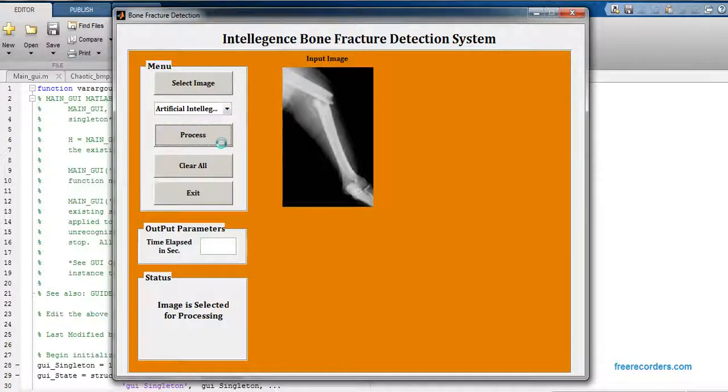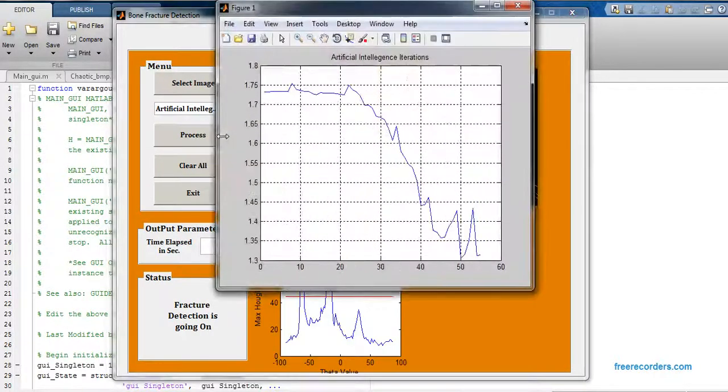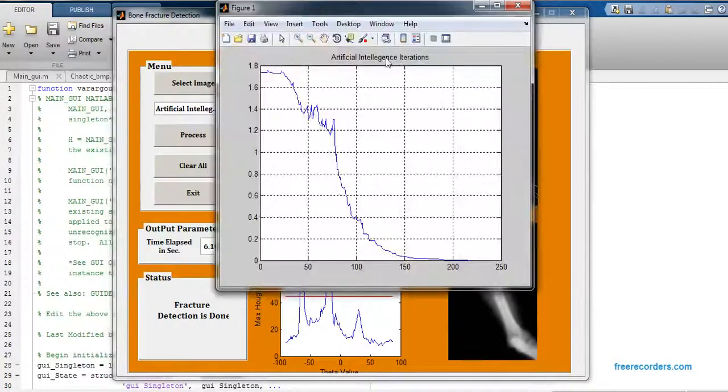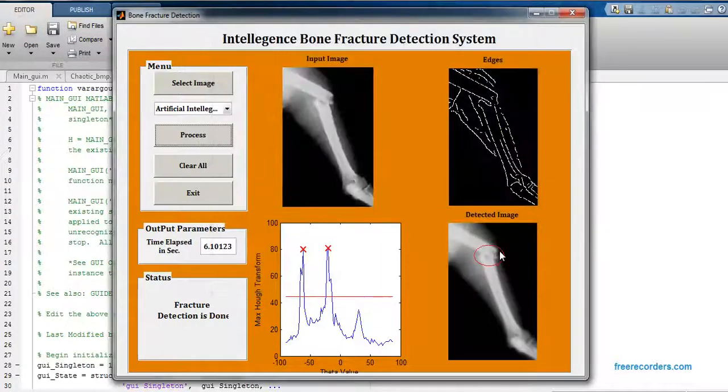And just click on process. So it will give you proper result. These are the iterations of the AI and here we get the respective output. Okay, now just clear all.